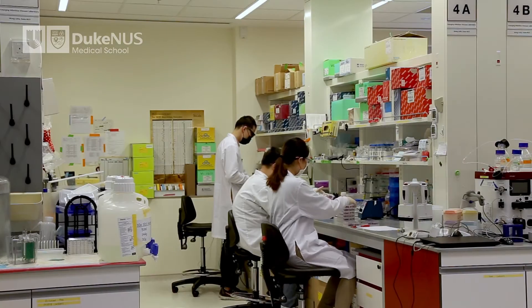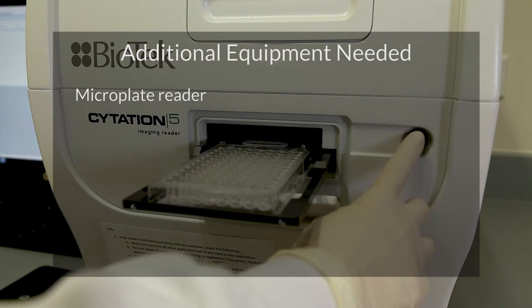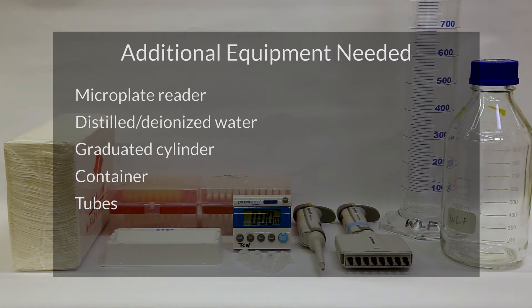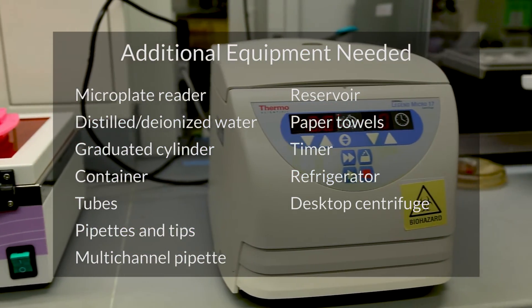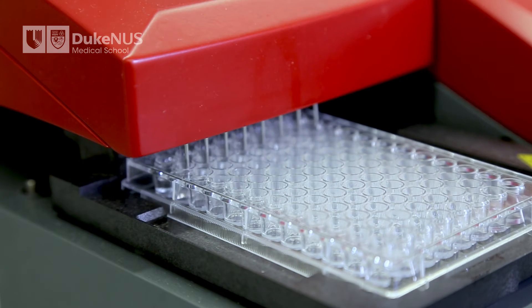In addition to what is provided in the kit, you will need the following laboratory equipment to run CPATH: a microplate reader with a 450 nm filter, distilled or deionized water, a graduated cylinder, a container to store the wash solution, tubes to aliquot or dilute samples, 10 microliter, 200 microliter, and 1 milliliter pipettes and tips, 200 microliter multi-channel pipettes, a reagent reservoir, paper towels, a laboratory timer, a refrigerator to store samples and kits, a desktop centrifuge, and a 37 degrees Celsius incubator. Having a microplate washer is also recommended.